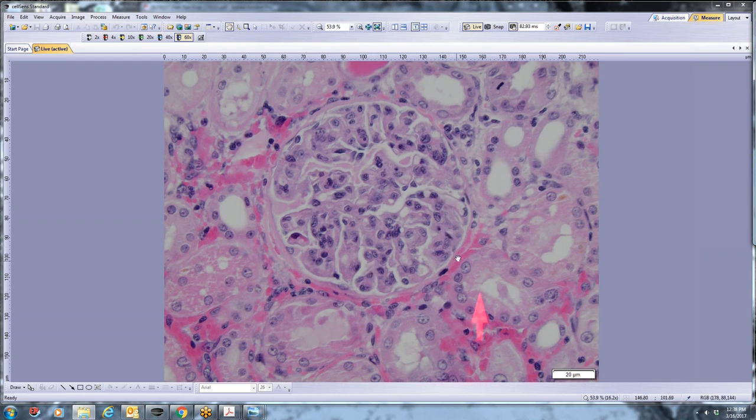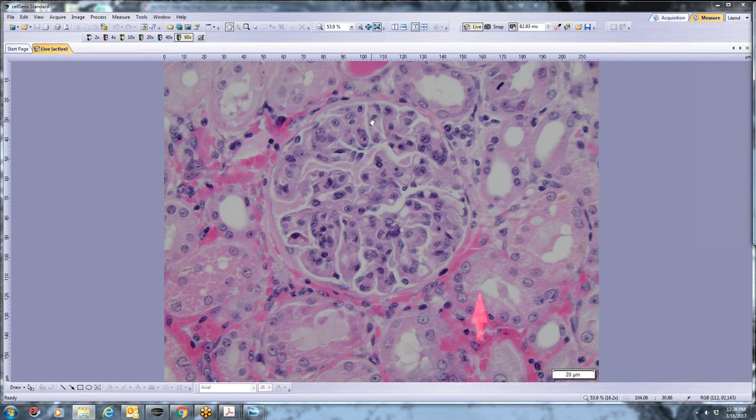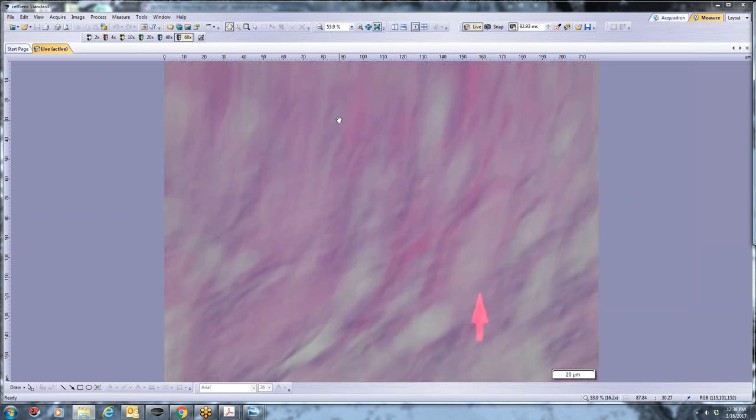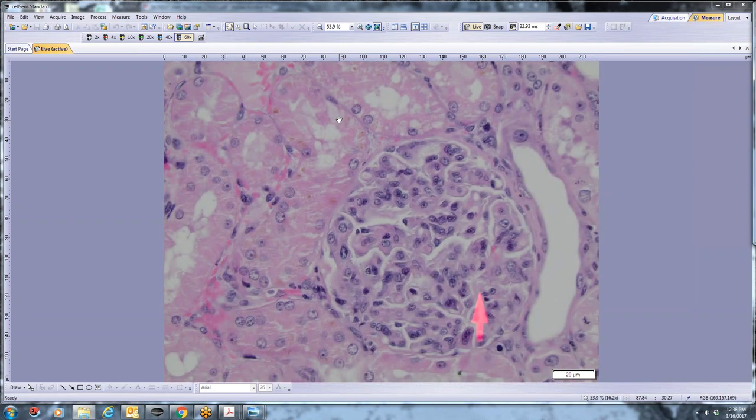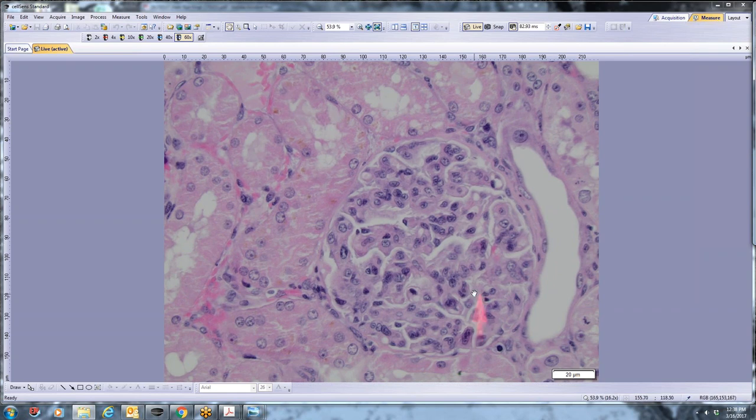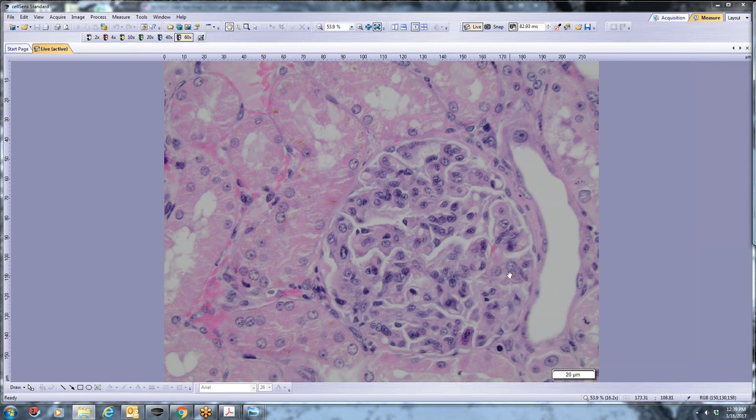And so glomerular tufts are hypercellular, as we've said. There's entire segments of peripheral capillary loops where you can't identify the lumen. And so it's hard to see the GBM itself, especially using the H&E stain. But that's a generalized issue throughout all of the glomeruli on the specimen. So it's a diffuse process and it's a global process with this degree of hypercellularity.